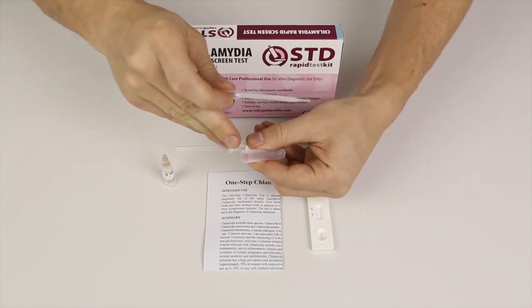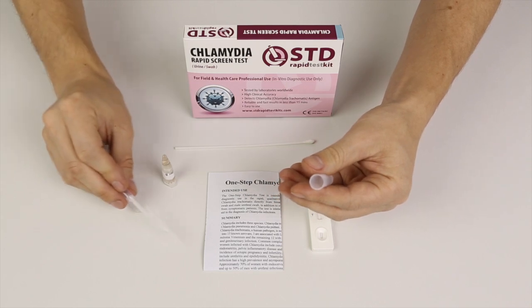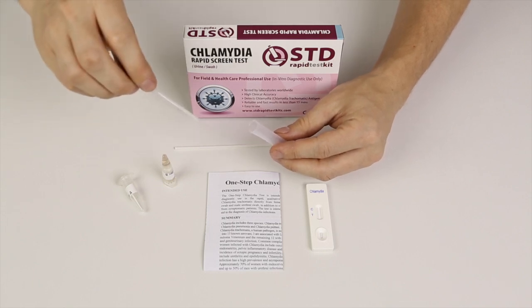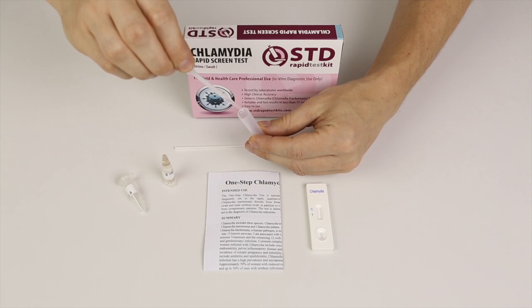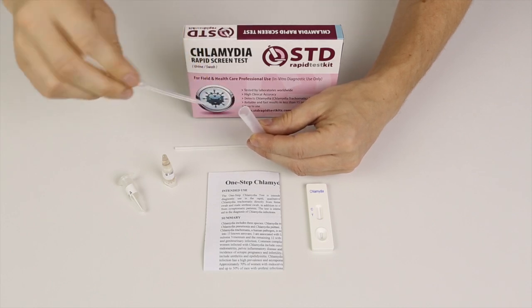I'll take eight or nine drops of buffer A out of the container, then cap the tube and put that back. I'll insert eight to nine drops here into the mixing tube — one, two, three, four, five, six, seven, eight, nine. That's it, and we're done with that.